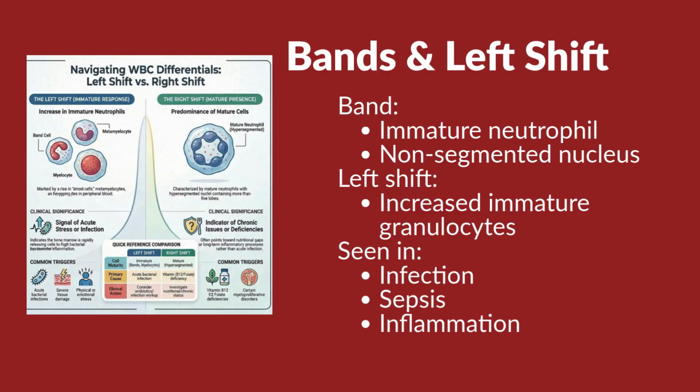Important MLS connection: a left shift often appears together with neutrophilia, toxic changes, or infection markers. This helps correlate morphology with disease. A left shift means the marrow is pushing neutrophils out early because the body needs help fast. That connection helps you remember both the morphology and the clinical meaning. Okay?